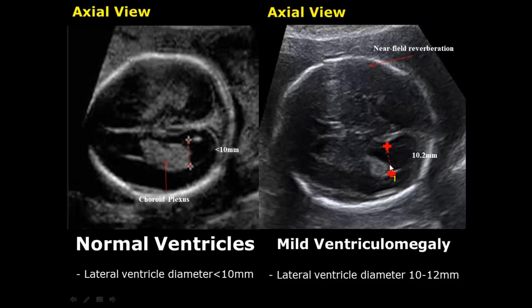Our first case is ventriculomegaly — the abnormal dilatation of the lateral ventricles. The diameter of the lateral ventricles must be less than 10 millimeters. The choroid plexus normally occupy the majority of the space and produce cerebrospinal fluid.